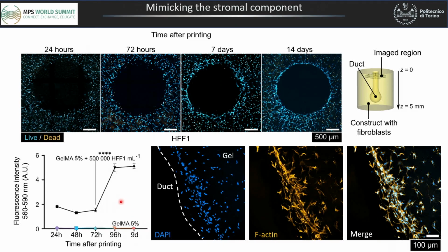And in particular, we observed a marked significant increase between 72 and 96 hours after printing, and this is probably due to the cell recovery from the stress that the biofabrication may cause. These fluorescence images also show the human fibroblasts assuming an elongated shape within the gel.